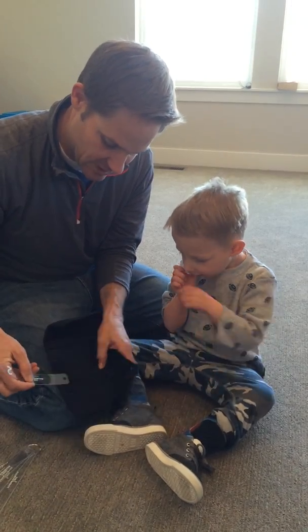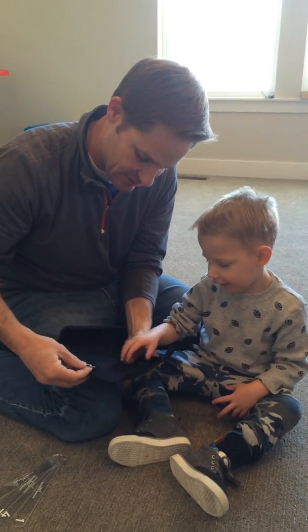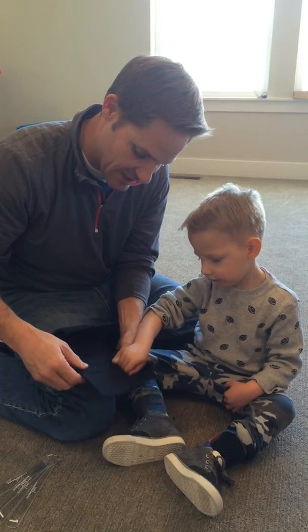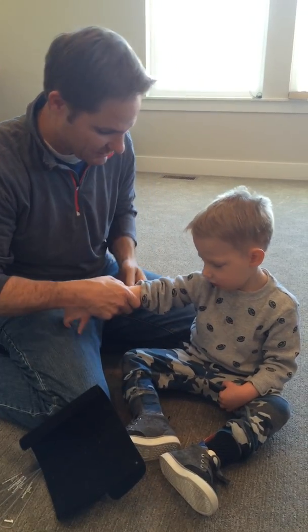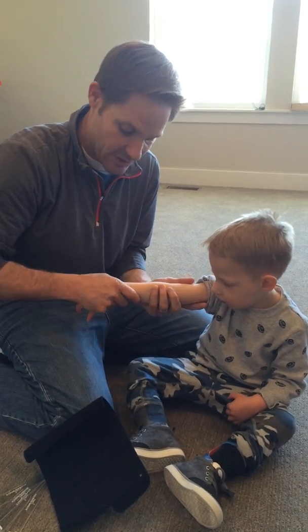All right, good idea. So we slide it in here like this on the inside. Slide it in there. We pull that end over it. We take Bronson's arm. I like it to be on the skin more than over clothing.